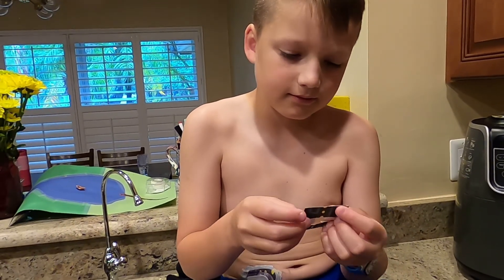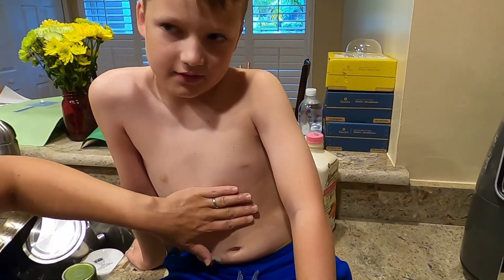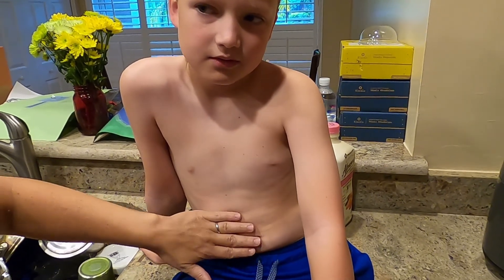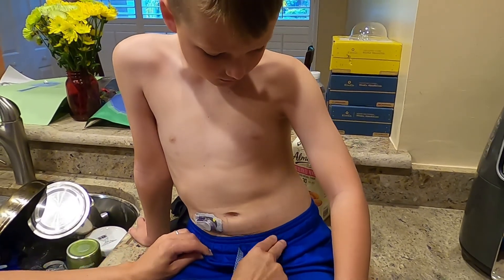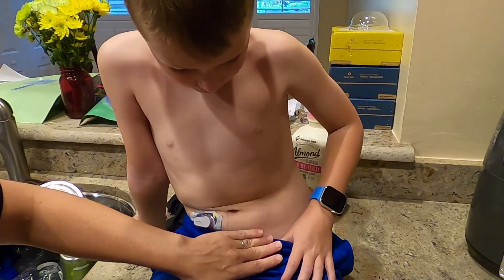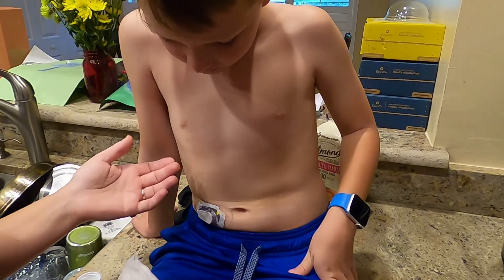Abel, do you have any advice for Porter before he does his first one? You have it figured out now, right? What we're going to do is we're going to put some Icy Hot right where we're going to apply it. We prefer the tummy, and that's the only place that Dexcom approves right now. So if we have a problem with it on the tummy, they will replace it. No problem. We rotate different spots on the abdomen every time. We just want to be careful. So a couple of considerations — we don't want to put it right where his waistband is going to go. Abel doesn't like it really high, so we just put it where his waistband will sit right below it. Seatbelts is probably another consideration, or any sports that you guys do, for placement. So we just let the Icy Hot work for a little bit.